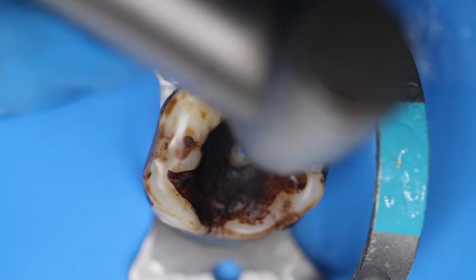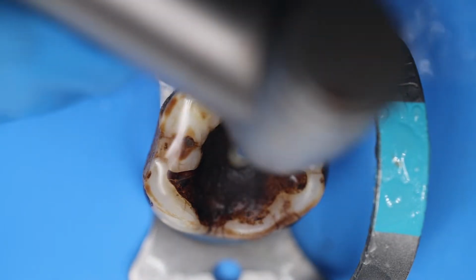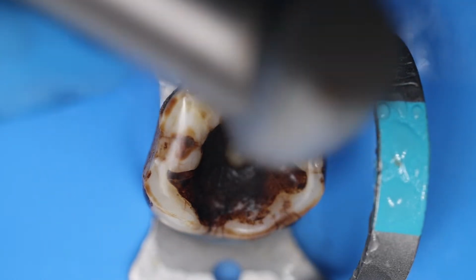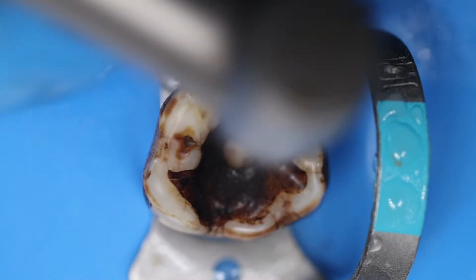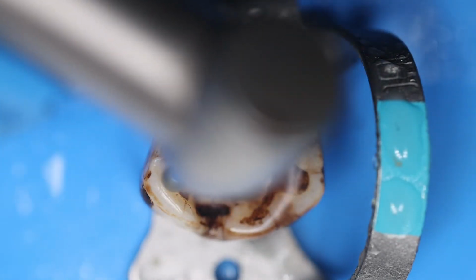When we are using the round burr, we are going very slowly so that you can understand how we progress. As you can see, we are progressing into the center. Now we can slowly also expand to remove the caries that is there on the occlusal aspect.